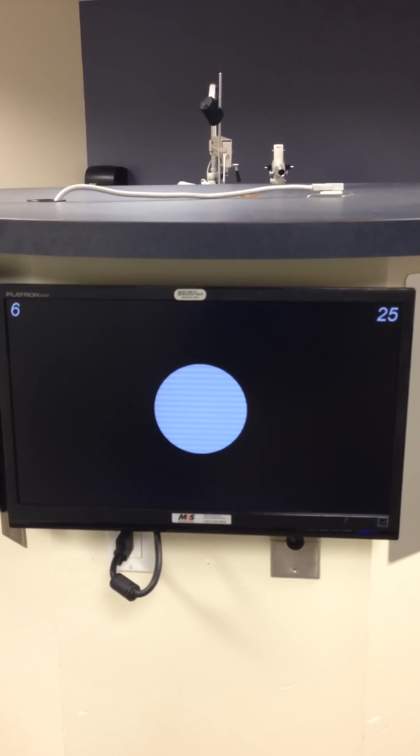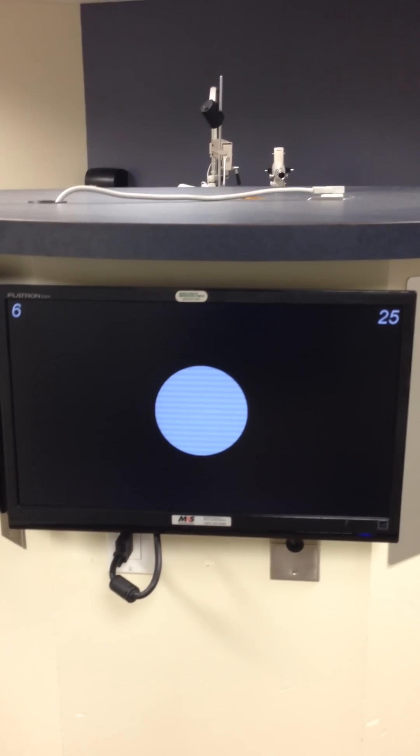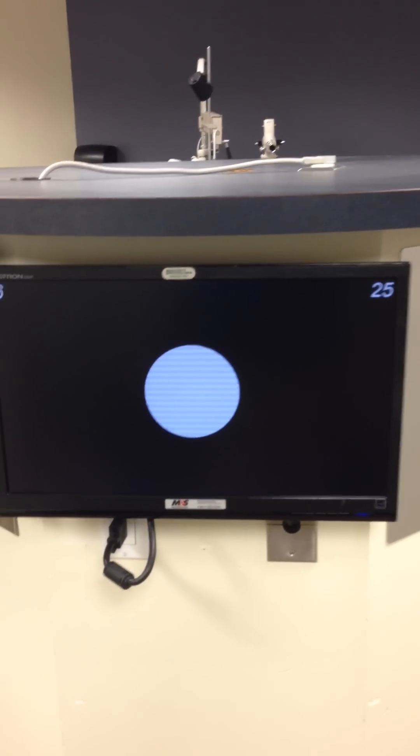So by the rule of 600, we divide 600 by 6, and we get 20/100 for the demand. On the right-hand side is the contrast, 25%. And then, of course, the patient will respond that the stripes are horizontal.